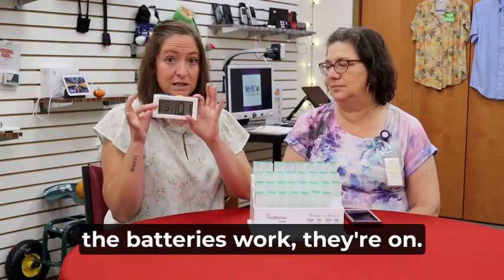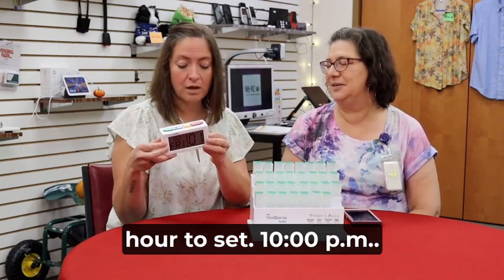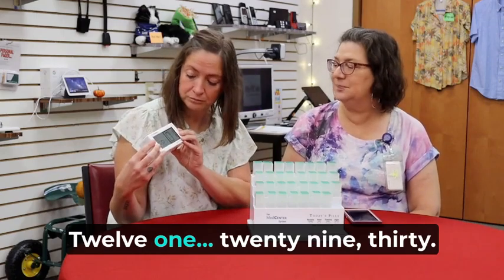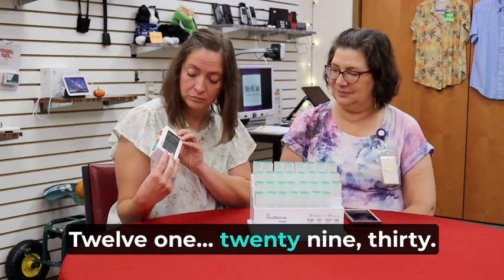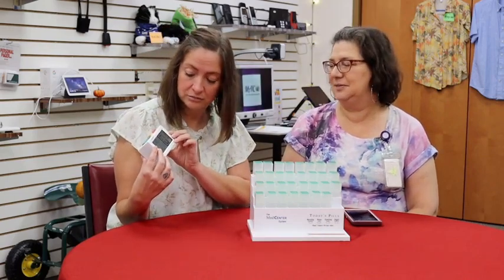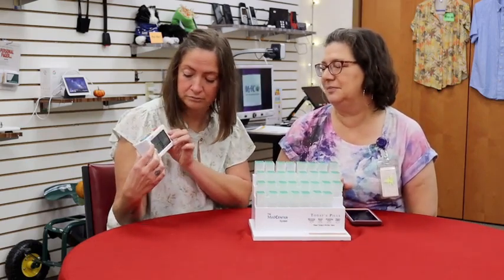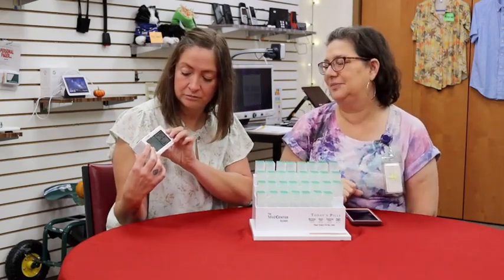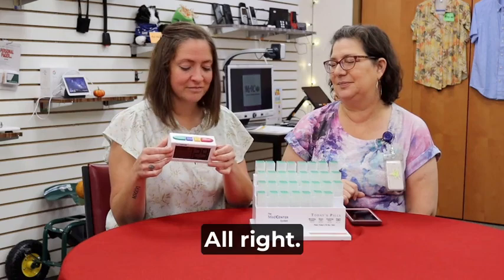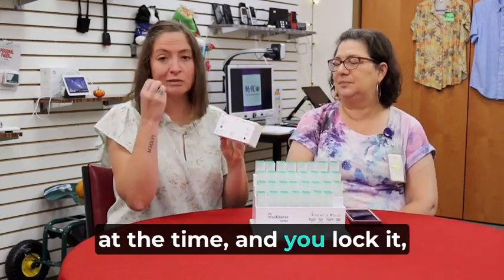It's very simple. As you can see, the batteries work, they're on, and let me set the time. Month set, year set, hour set. Okay, it's 10 p.m. Month set, January. Not January. So as you can see, this is a talking system. Yes, definitely talks to you. All right. Hour set, 10. So now, once I'm done, I put it in the middle, if that was all you wanted to do at the time, and you lock it, so then it's set.